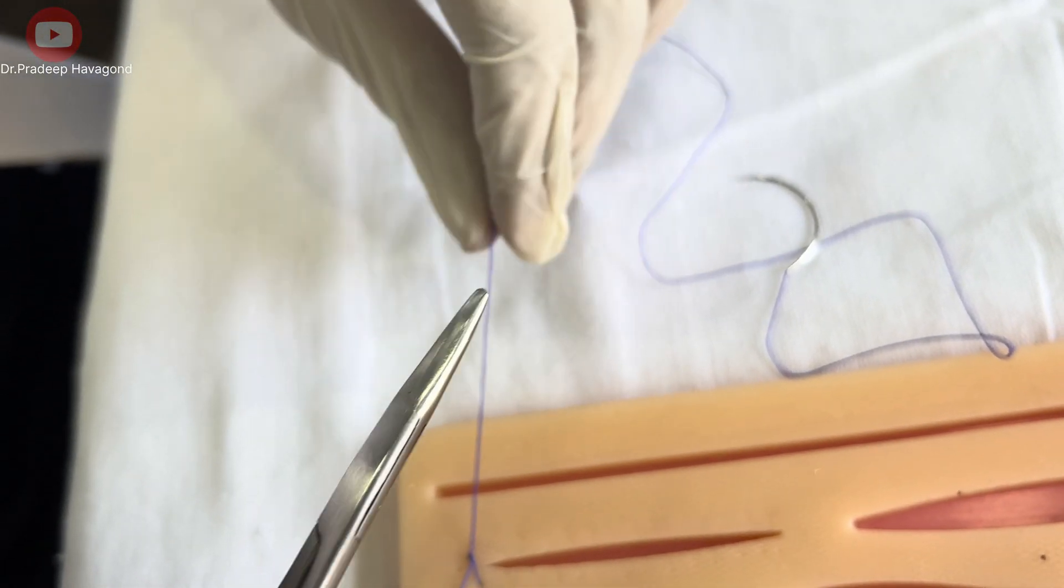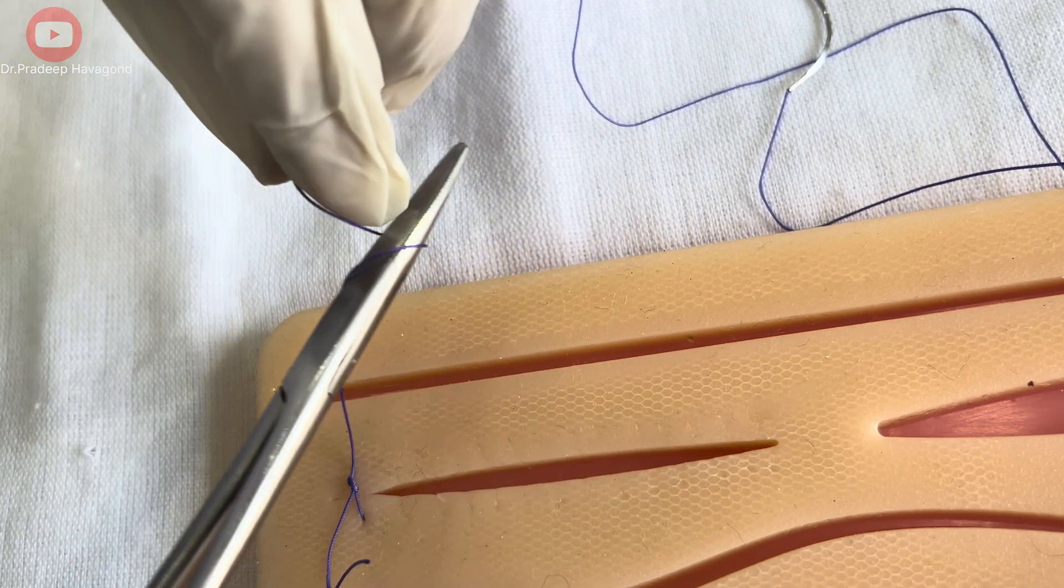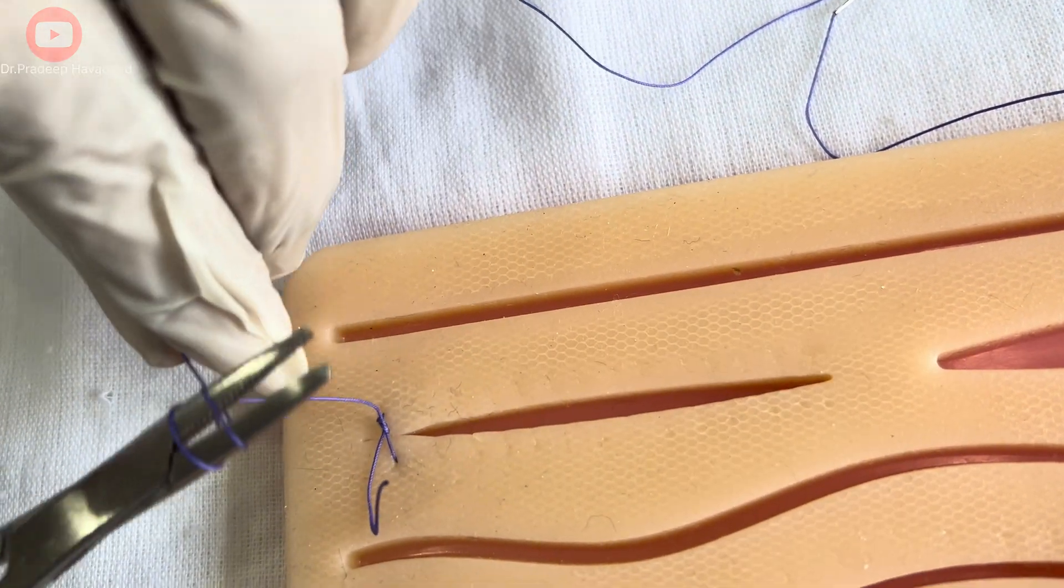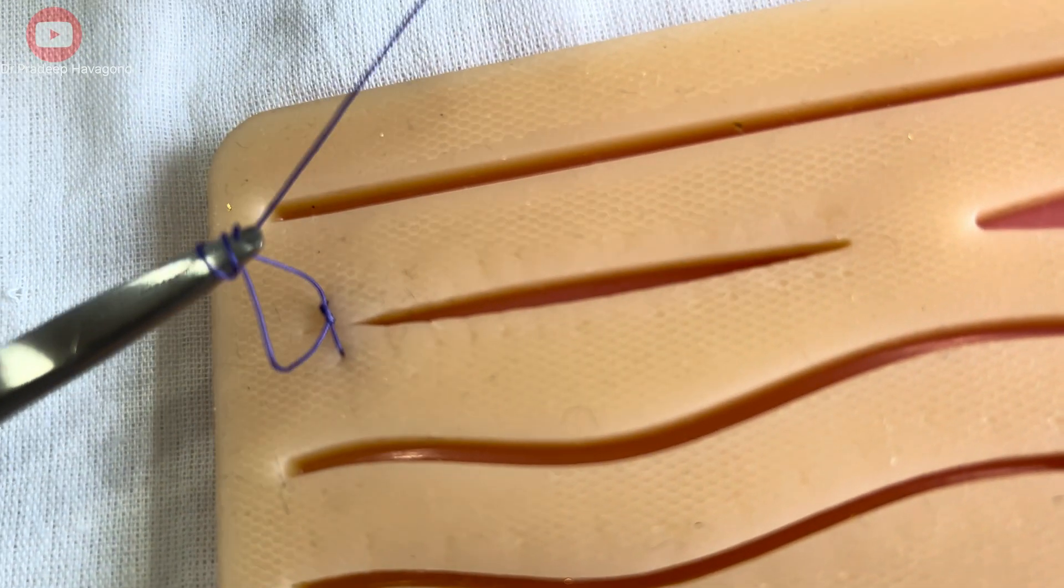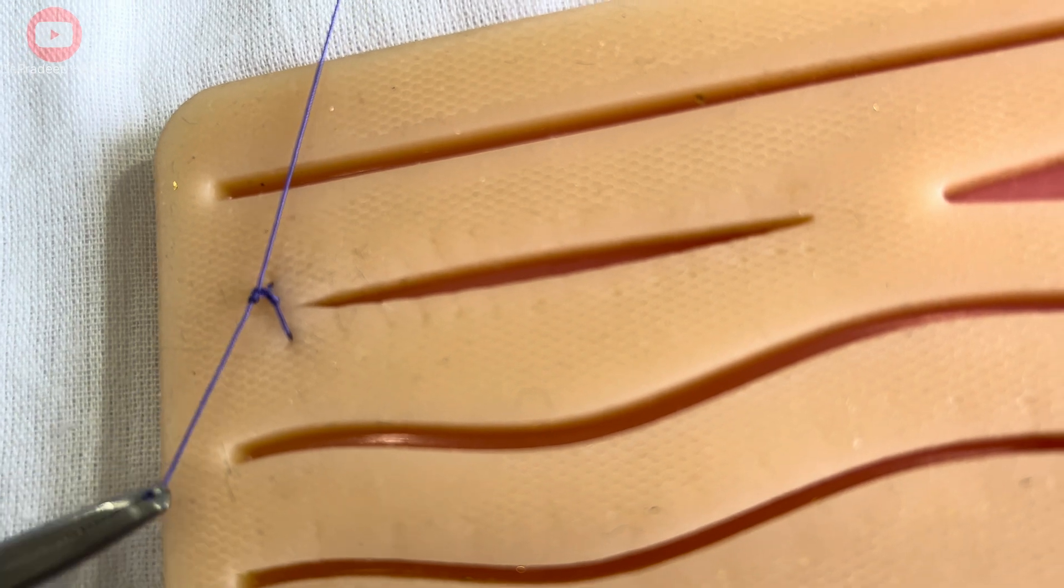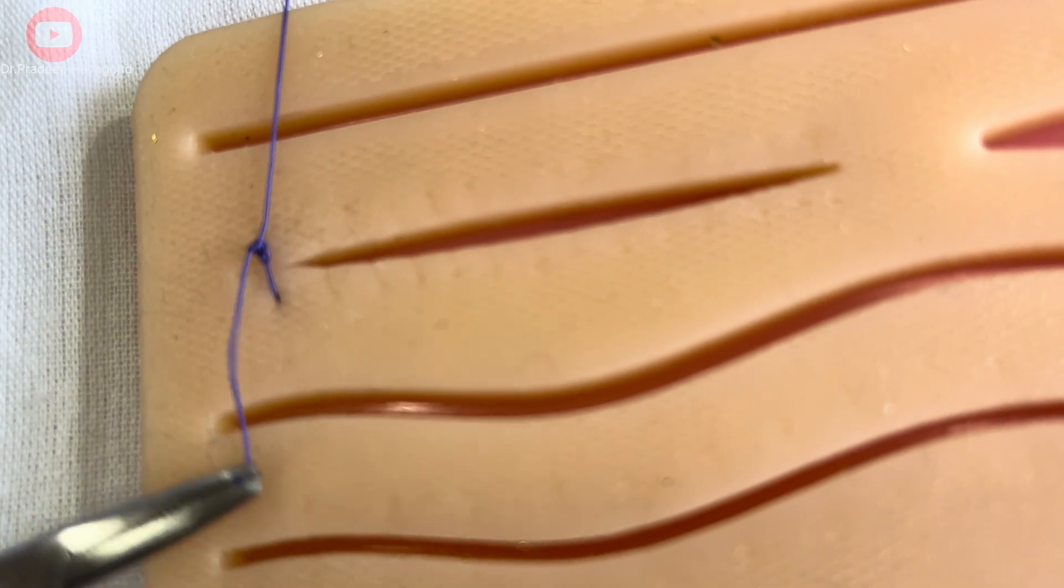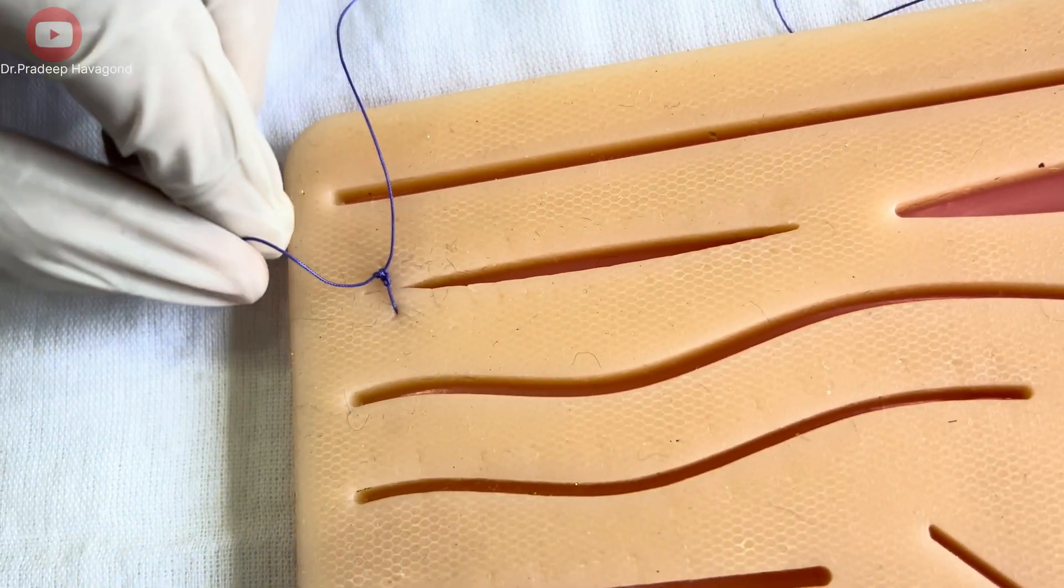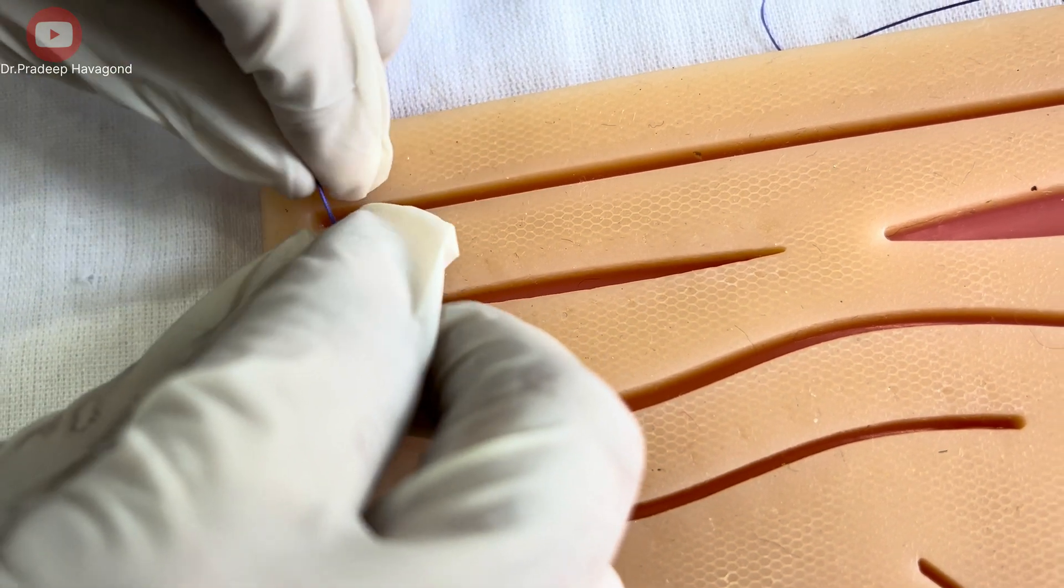Remember, for a square knot, you want the first throw to be in one direction and the second in the opposite direction to prevent the knot from slipping. Make sure the knot forms neatly and trim any excess suture material.